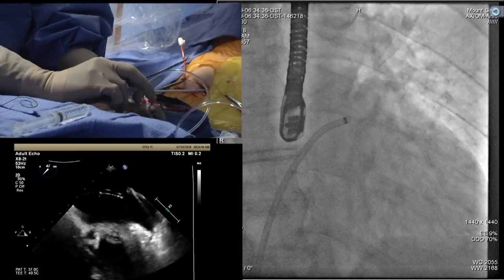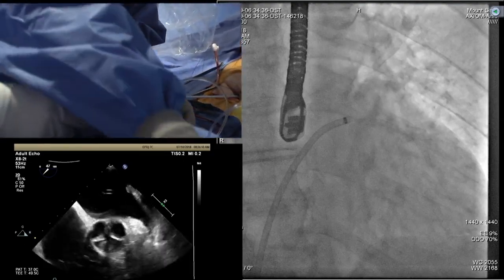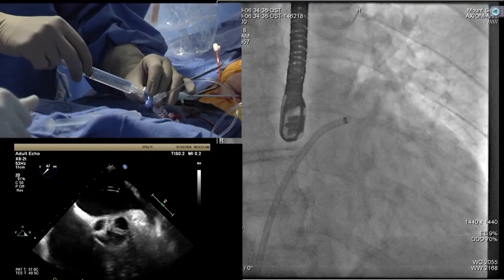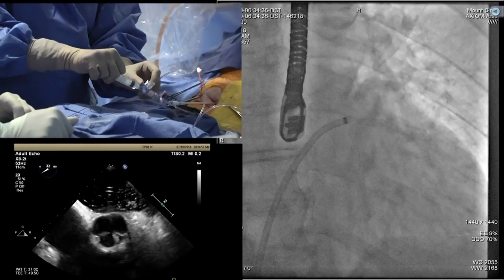So first thing you do is give the full heparin. You want to do another measurement? It's running now. Okay, good. You give six. Now the other thing is the height measurement. Gila, you want another six, or are we good? We don't need it. Total. I'm giving a pressure.